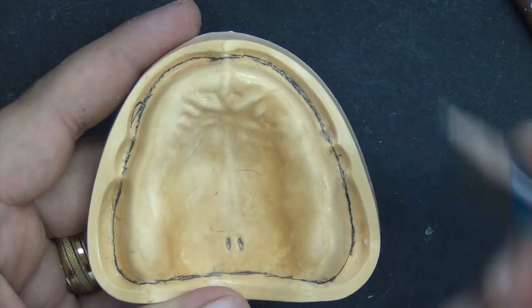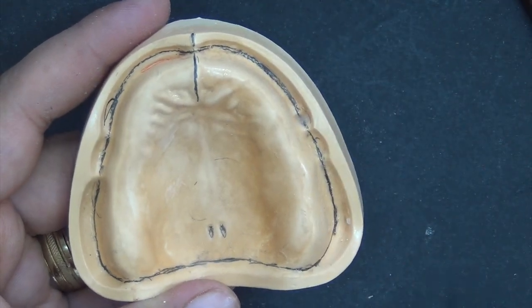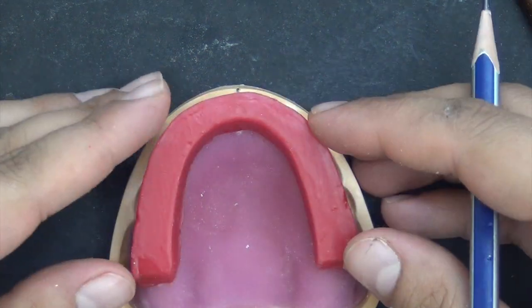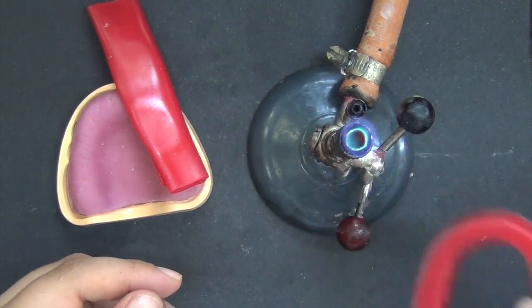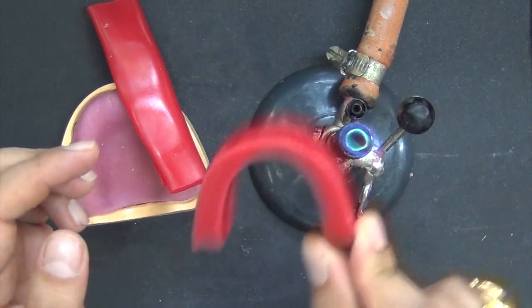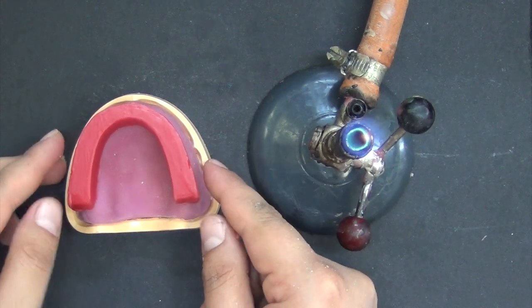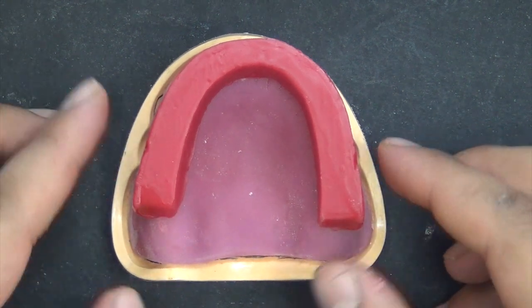Mark the midline on the cast and on the temporary denture base to make sure that the rim would be centered over the ridge. Soften the occlusion rim over the Bunsen burner and open it slightly to adapt it to the arch form of the residual ridge. Place the occlusion rim labially and buccally to the residual ridge.